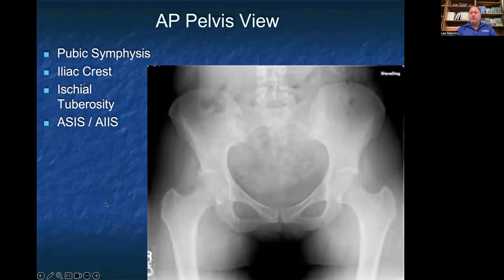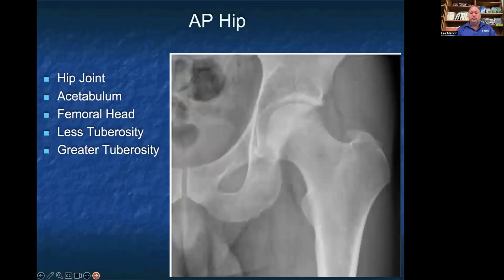In the AP view, this gives us a great view of the pubic symphysis. We also can look at the contour of the iliac crest, the ischial tuberosity where the hamstrings attach, the anterior superior iliac spine where the sartorius attaches, and the anterior inferior iliac spine where the rectus femoris attaches. The AP view of the hip gives us a closer look at the actual ball and socket of the hip joint. We can see the acetabulum and evaluate the shape and contour of the femoral head. We also have a better view of the lesser tuberosity where the iliopsoas attaches, and the greater tuberosity.